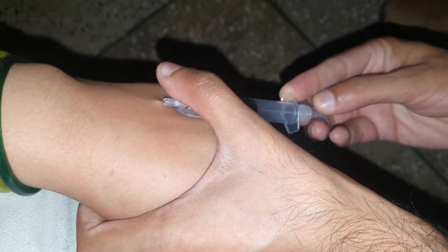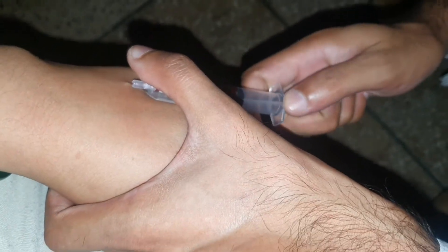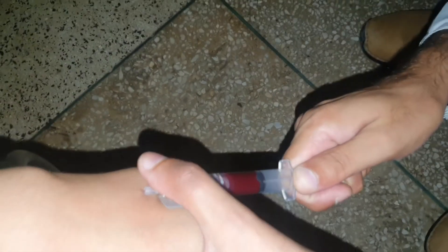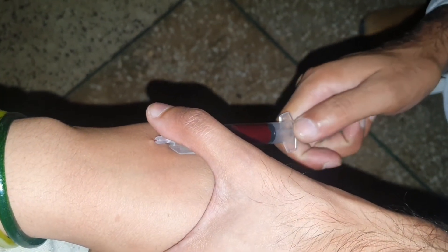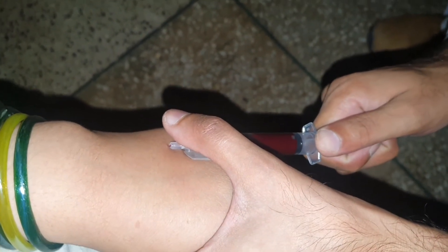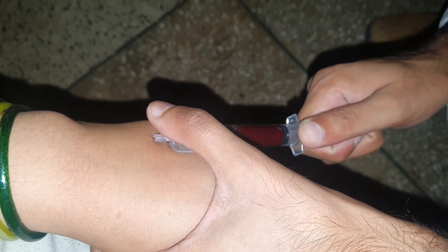Now if you have to take samples, then place a syringe and take blood samples. After taking blood samples, you secure the cannula by using some stickings. So this is the whole procedure of passing a cannula. Hope you will like this video.